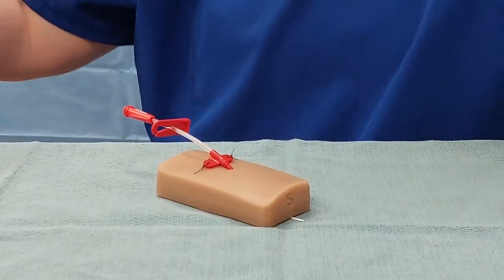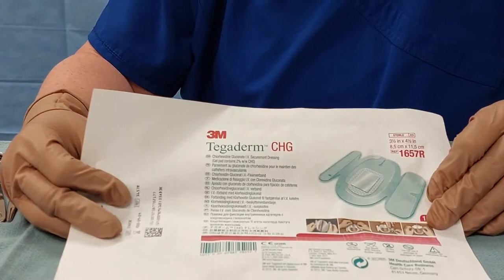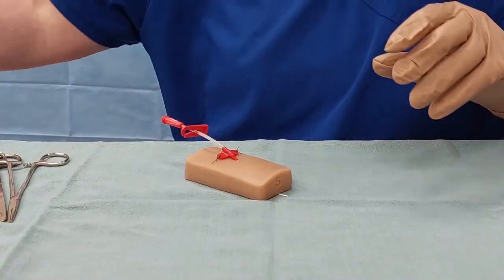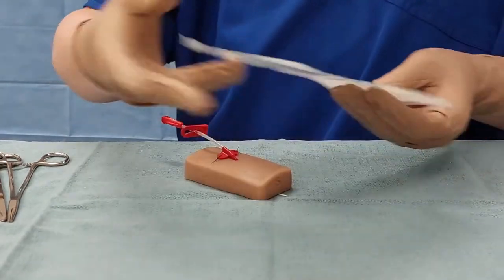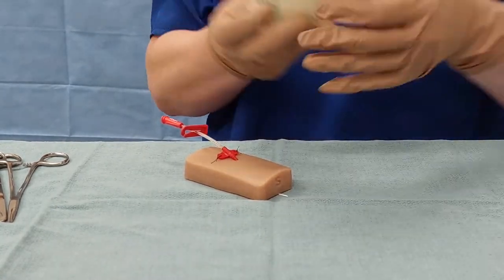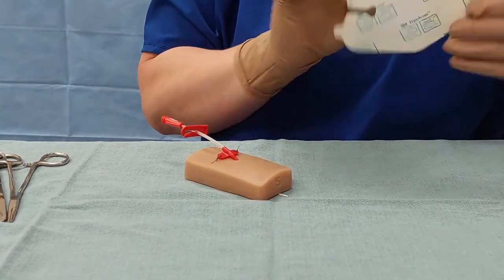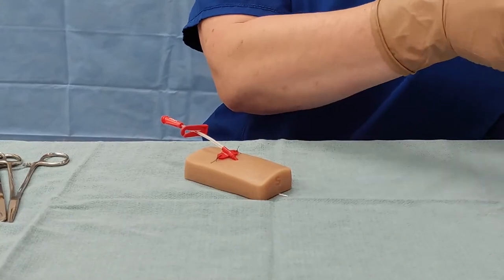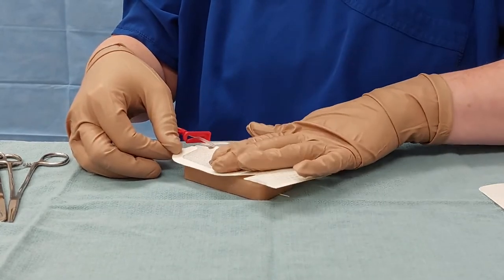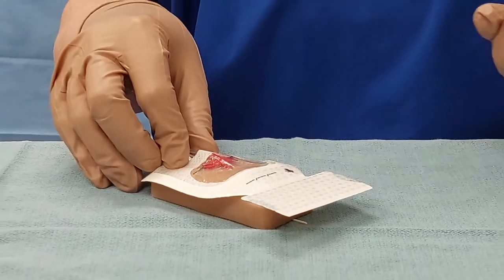Now we're going to dress the Artline. You can choose any adhesive transparent dressing. We recommend using the CHG Tegaderm dressings if they're available; otherwise, you can use any of the Tegaderm IV adhesive dressings to secure your line. I'm going to use the small one today — this is a Tegaderm IV Advanced. Make sure the window in the dressing keeps the insertion site visible, so you can see both your sutures and the insertion site. Tease that down, pull off the paper tape, and you're going to connect your line and carry on.